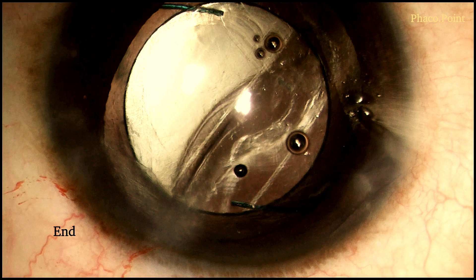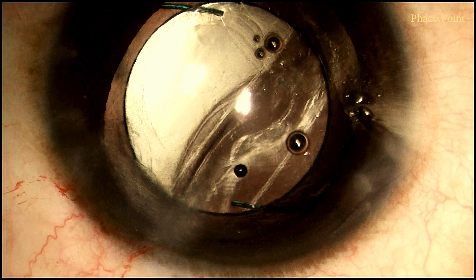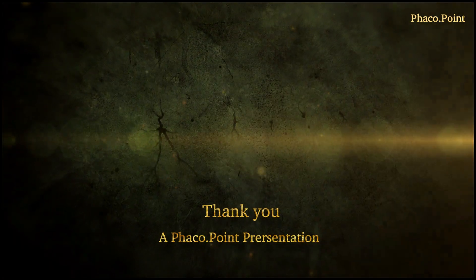You can see the end result achieved here: an anterior chamber free of epinucleus, cortex, or vitreous; a stable posterior capsular rupture; and a stable placement of a 3-piece IOL in the ciliary sulcus with the haptics at right angles to the PCR. After completing the IOL insertion and ensuring its stability, the excess viscoelastic is washed out from the anterior chamber and the wounds hydrated. I hope you did find this video tutorial useful. Thank you.